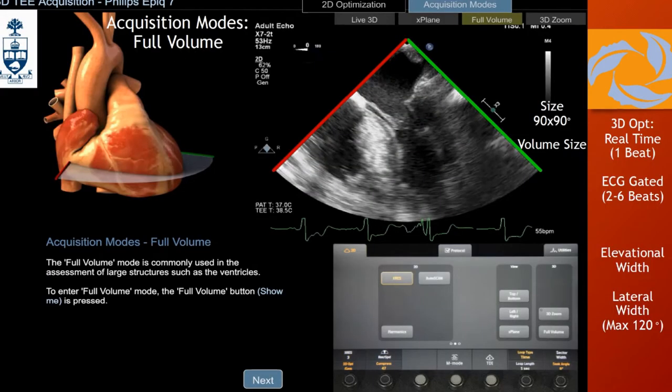Another mode is full volume — this is going to be a 90x90 degree pyramid. You can increase it to a maximum of 120x120, which is pretty good. This is the modality you want to use when assessing your right ventricle or left ventricle — big structures. I always like to have my 2D planes visible: 4-chamber and 2-chamber, to be sure I'm including the whole ventricle. It's important to know that the image generated is from the back of the heart — if you have the whole 90x90 pyramid, you'll only see the surface and everything will be yellow.